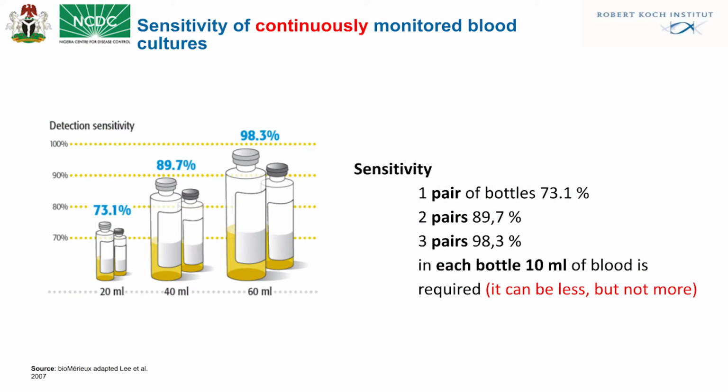The sensitivity has been seen to be increased when pairs of analyses are carried out. Apart from the pediatric, which has a single bottle, for the adult analysis, they have both the anaerobic and aerobic bottles, and collecting more than one pair has resulted in increased sensitivity drastically.